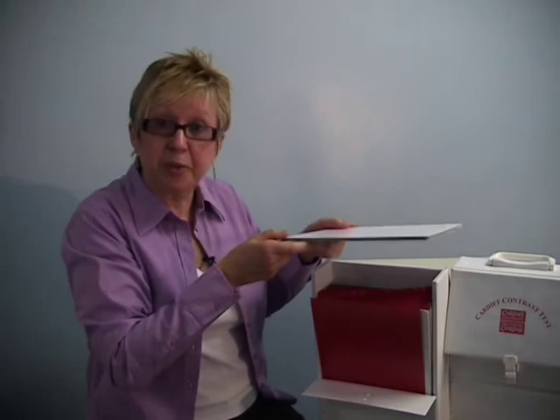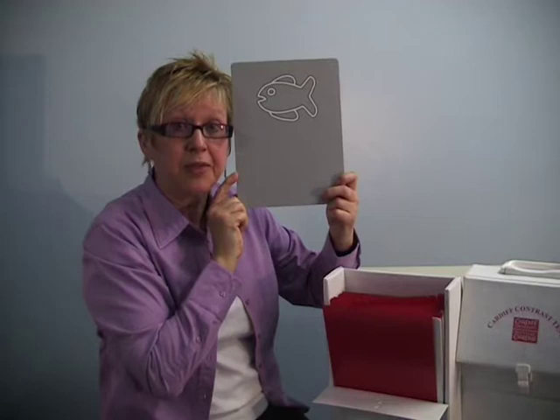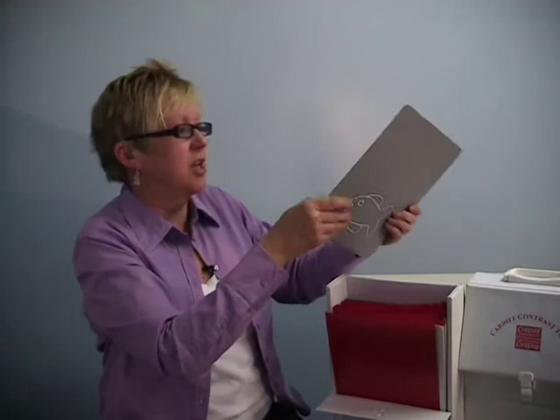The easiest way to judge eye movements is to place the picture so that my eyes are in the centre of the card. I'm then looking to see whether the child looks above or below my eye level. We look for the first eye movement and make a mental note of it, go on to the next picture, make a mental note of the child's eye movements, and only then do we check to see if we're correct.